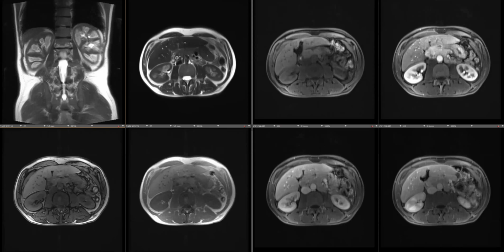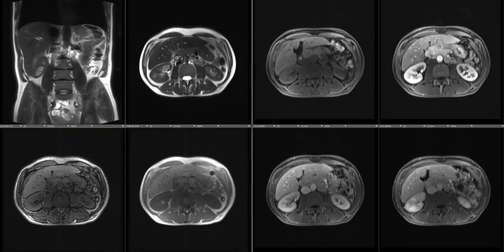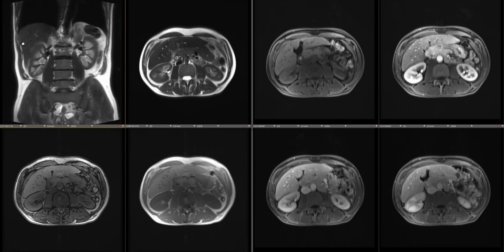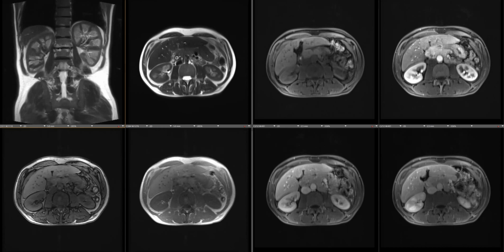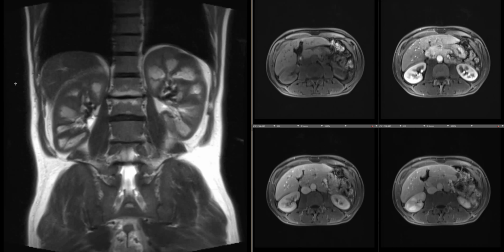Okay. So I'm going to lead you through this one because there are a lot of findings, but I think the end diagnosis is pretty cool. As I start here on the coronal T2 HASTE, can you double click when you go through the sequences? So yeah, it blows up. Yep, perfect. So do the kidneys strike anybody? Yeah, exactly. So first we see that the kidneys are abnormal.